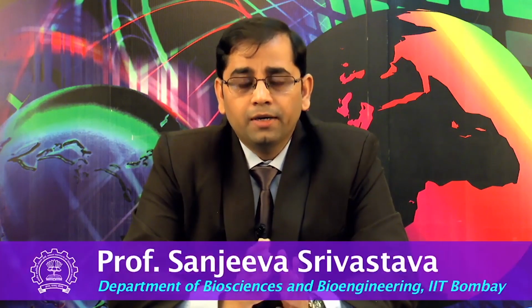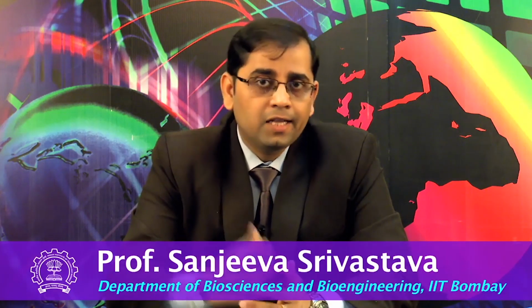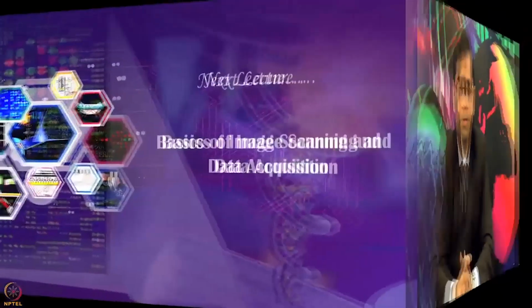So, we will continue this discussion about using the purified protein based arrays in the next lecture as well, and you will learn about how the microarray data can be analyzed, especially coming from such large data sets where many types of control spots become very crucial, and your considerations about how to ensure that what we are identifying is the right spot, it is not an artifact, it is not a false positive. These considerations can only come when we talk in detail about the data analysis aspect. So, we will talk to you about the microarray experiment and same application and data analysis in the next class. Thank you.